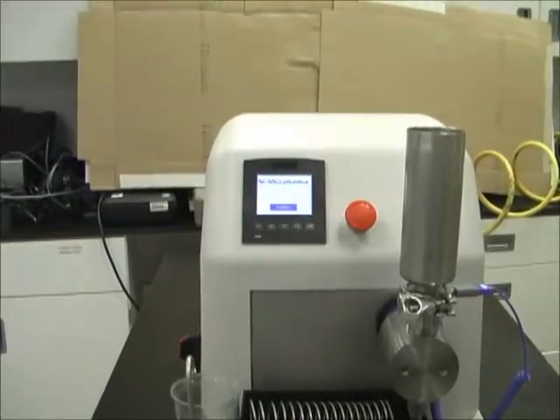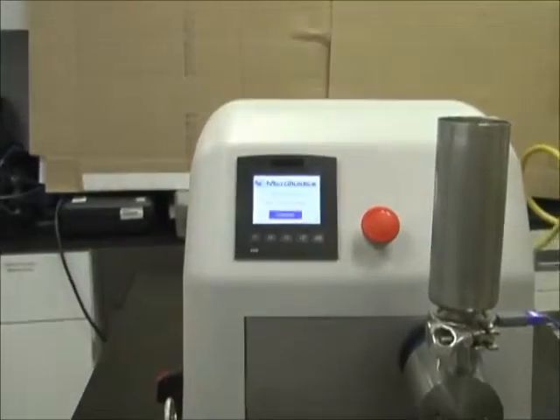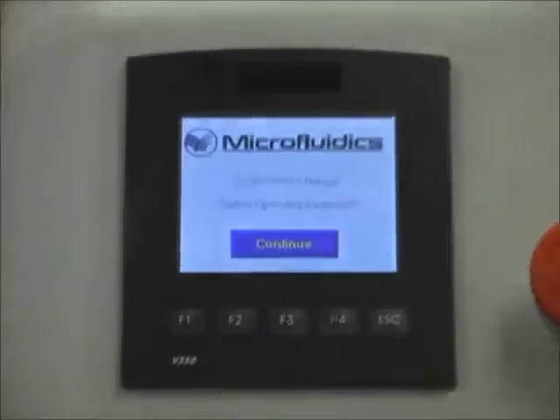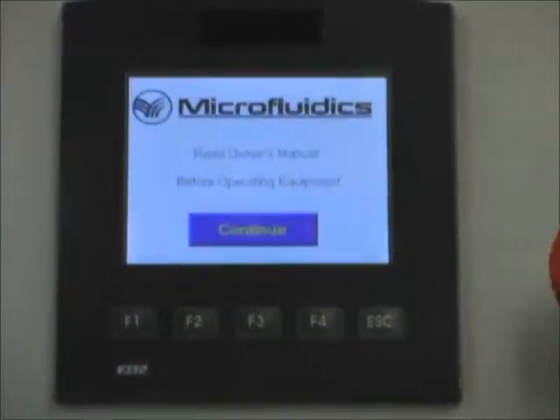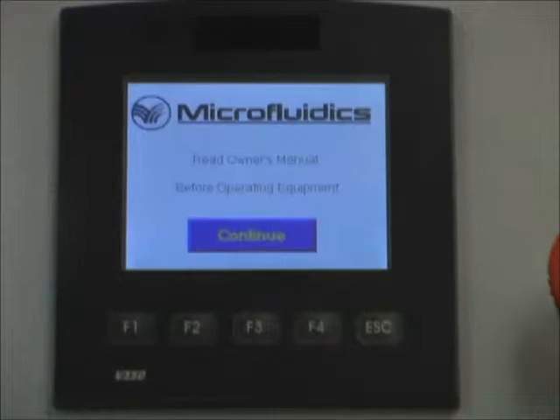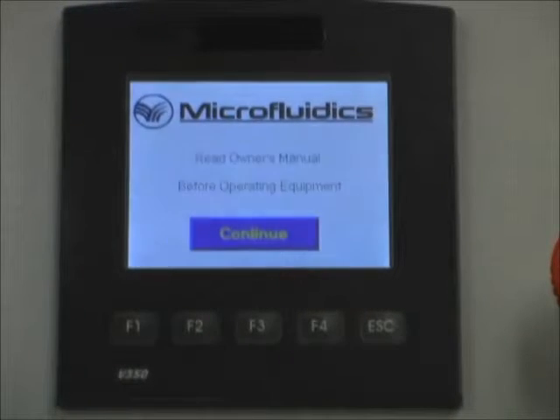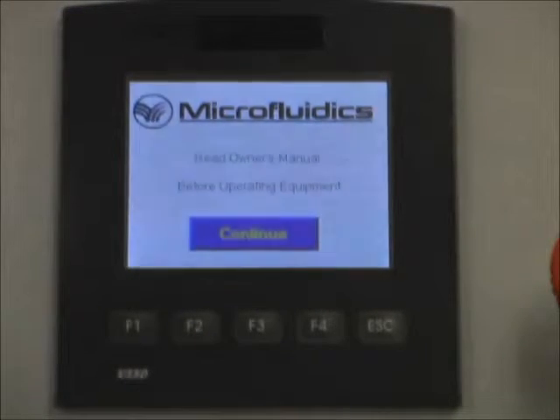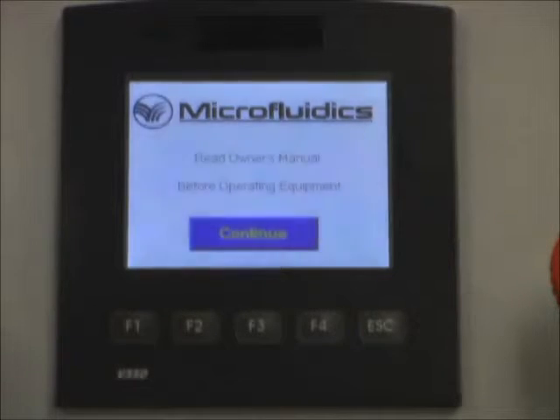We can see the PLC starting up and the home screen. This first screen alerts the user to read and understand the manual before they run the processor. We will touch the continue button.